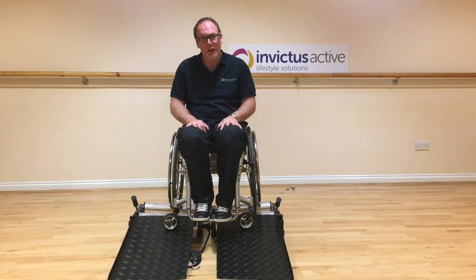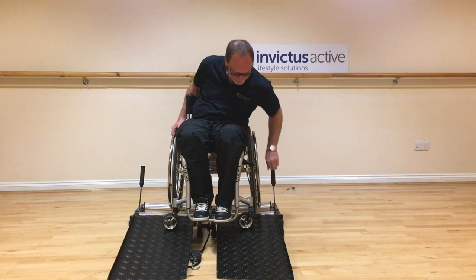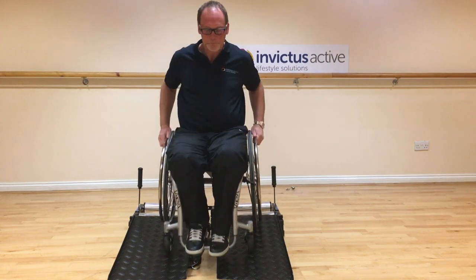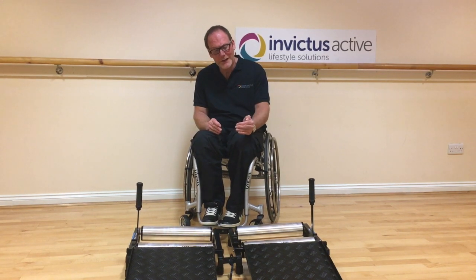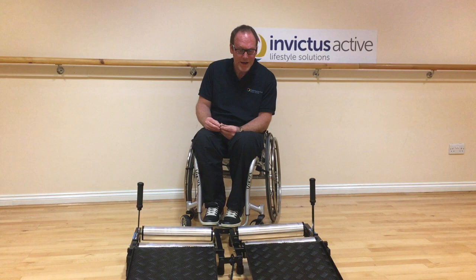First thing you're going to need to do is just wheel off the trainer. So we've established that this chair travels to the right. To correct that, it's quite simple. All we need to do is move this left hand side of the trainer back slightly.